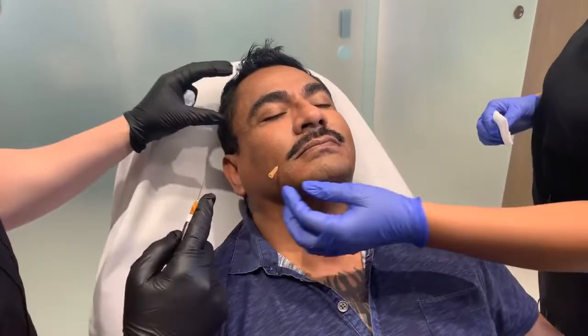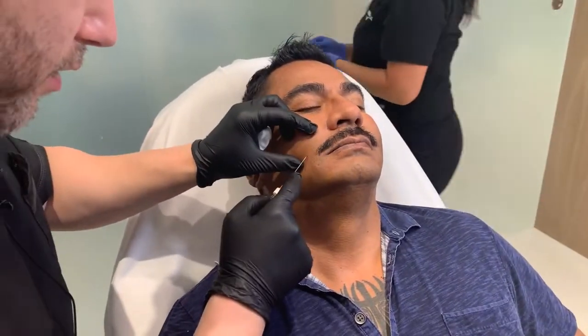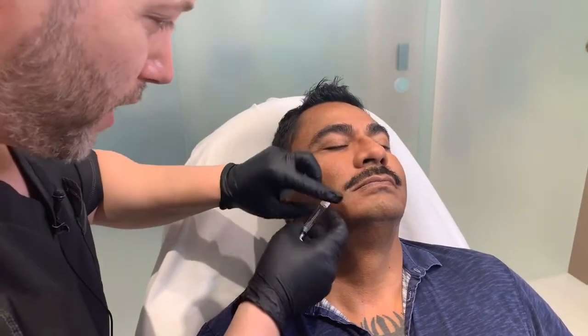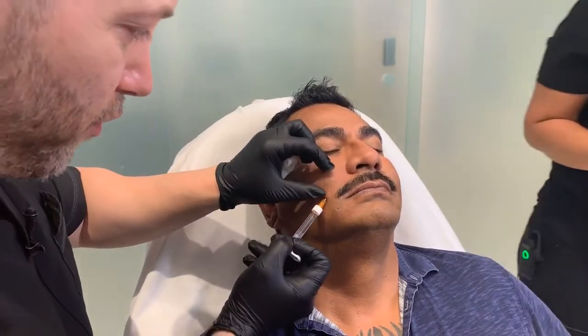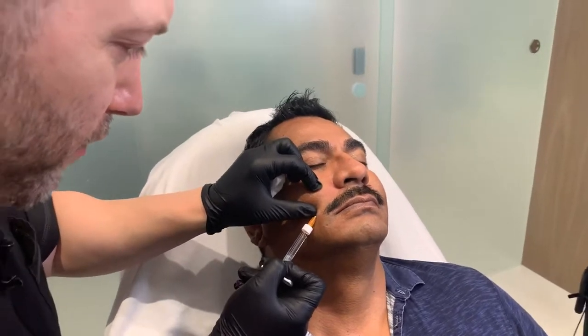We're going to use a cannula. So it's great. This area is really good. Turn a little left for the cannula, because you can go right in the tissue with almost no pain. We can do a little tap, tap, tap, and we're right there in the deeper area of the fold. And we just go nice and slow, and we get that to rise.